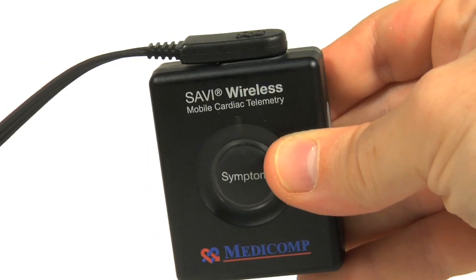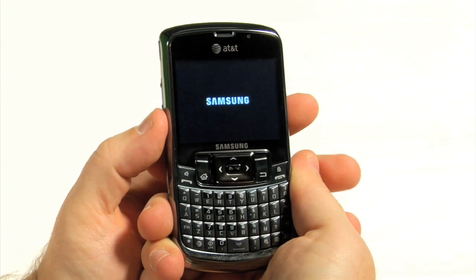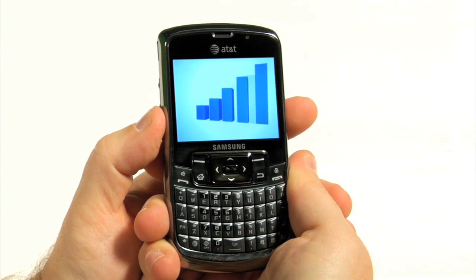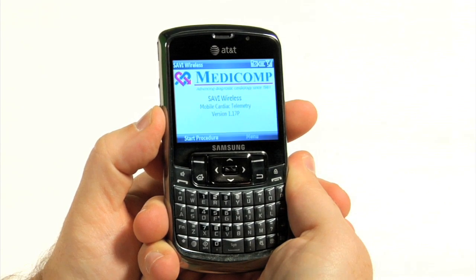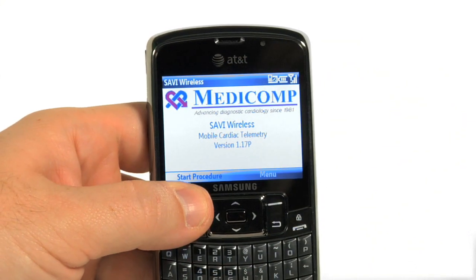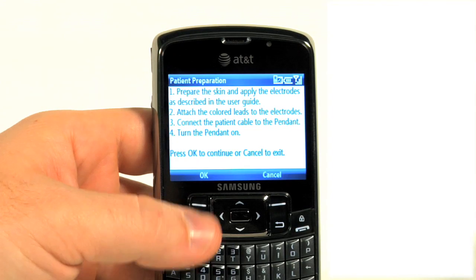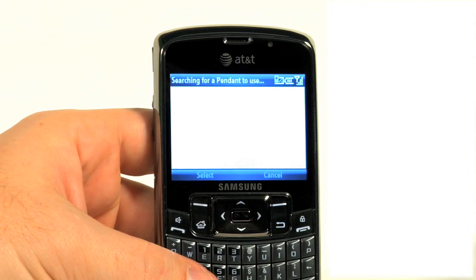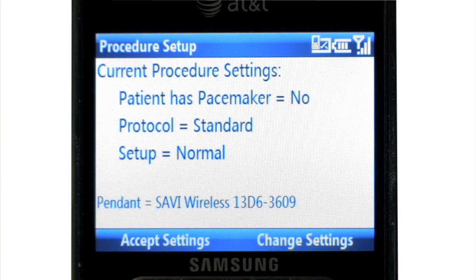Turn the smartphone on by pressing the power button located on the left side. The smartphone will run through its initialization until the main screen appears. Press the left soft key under 'Start Procedure.' The next screen will give instructions on applying the electrode patches. Press the left soft key under OK on the smartphone and go to the next step.